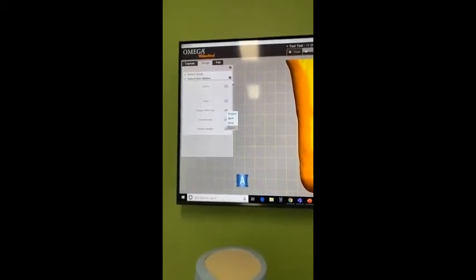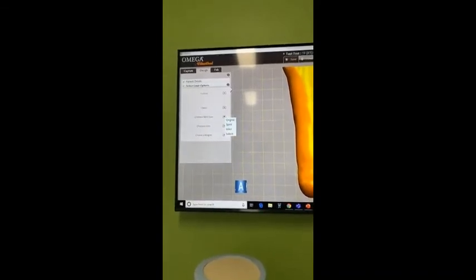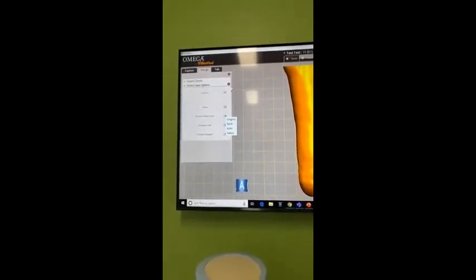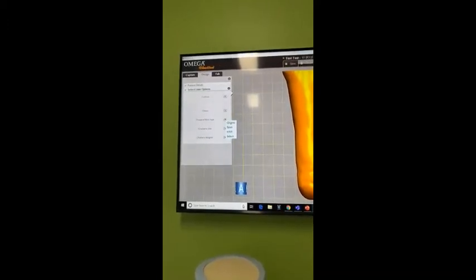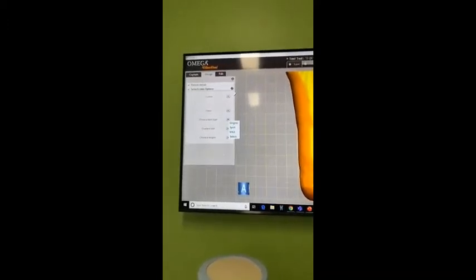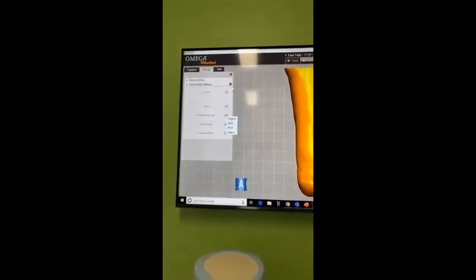And then our Select fabric is our fabric where we have the two-way stretch panel anterior over the front of the knee, and then the rest of the fabric only stretches in one direction, and that stops elongation and pistoning of the stump in the liner.